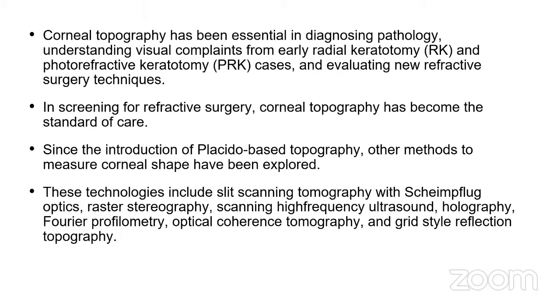Since the introduction of Placido-based topography, other methods to measure corneal shape have been explored. These technologies include slit scanning tomography with Scheimpflug optics, raster stereography, scanning high-frequency ultrasound, holography, Fourier profilometry, optical coherence tomography, and grid-style reflection topography.